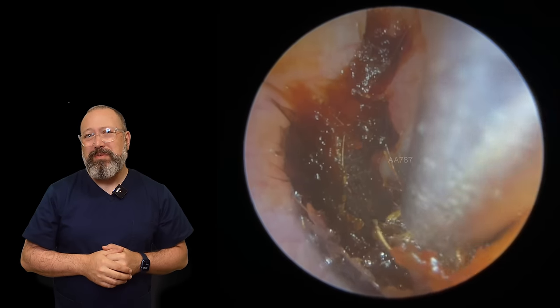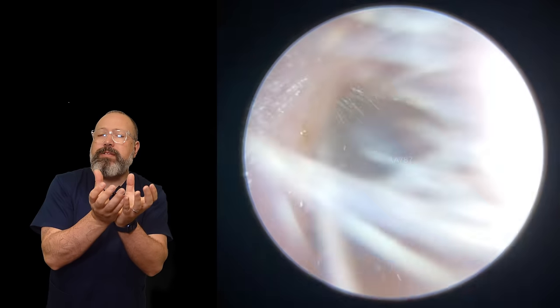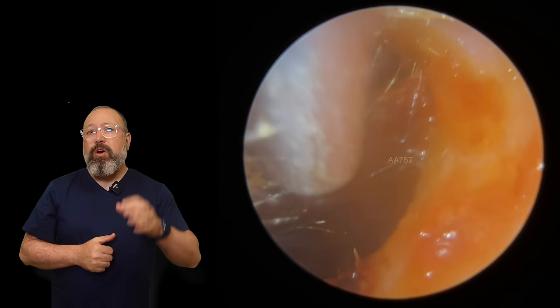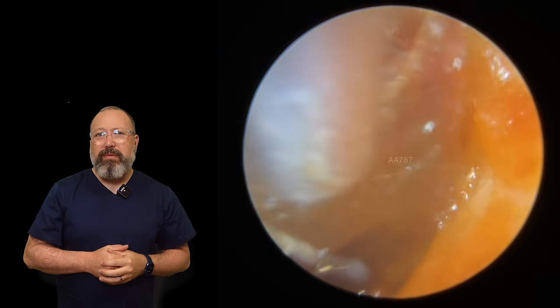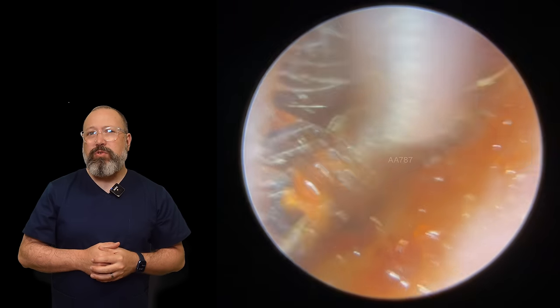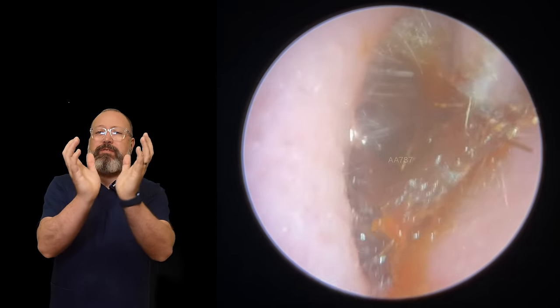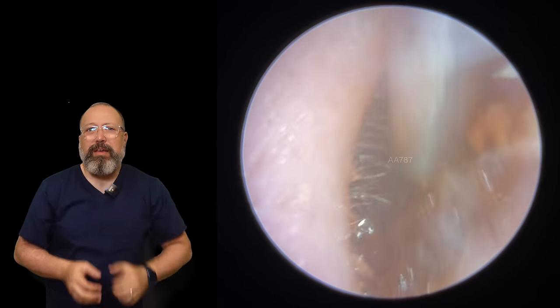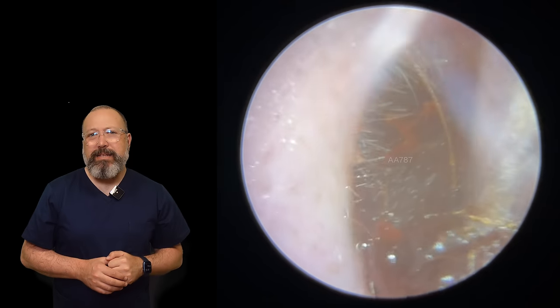We've got this little horseshoe-shaped piece of wax coming away now. We've had to switch down to the fine end because with the standard size tube you just wouldn't get the grip. You can see that's really coming away nicely. It's an awkward shape — with that U-shape or horseshoe shape as you bring it out, you have to twist it to get onto the side of it and then bring it out. A little bit of maneuvering needed in this section.